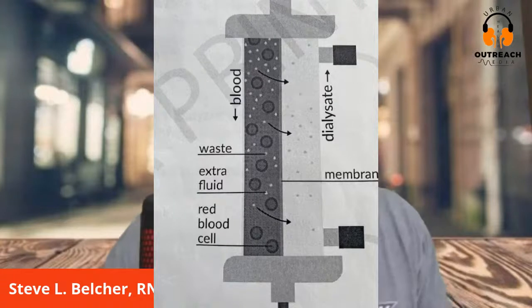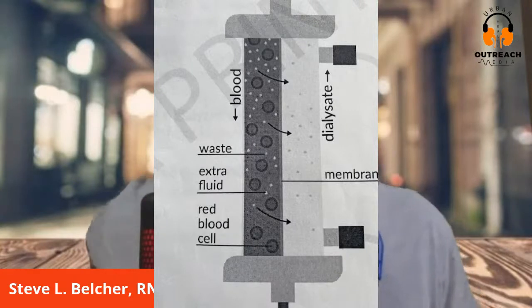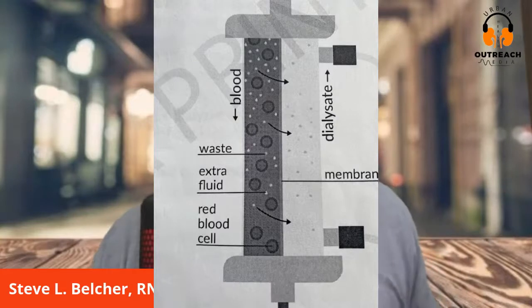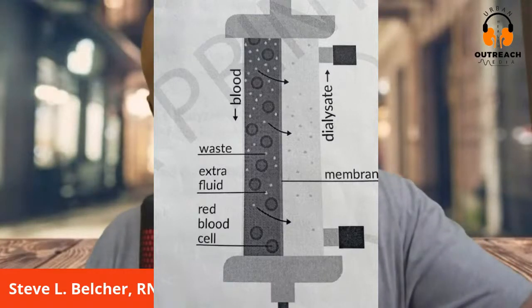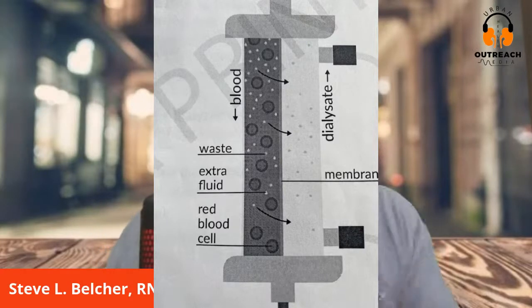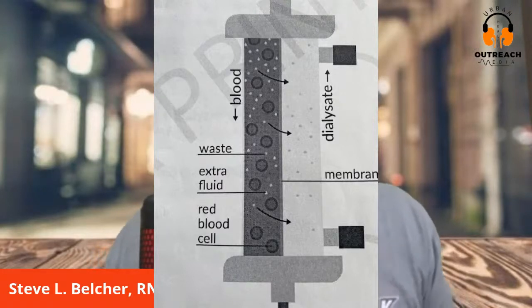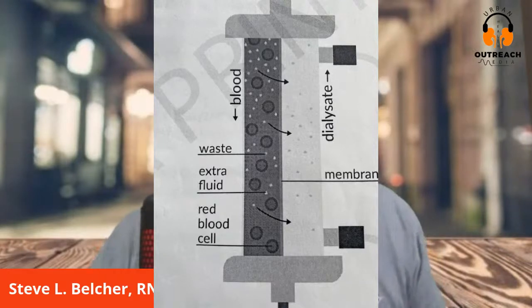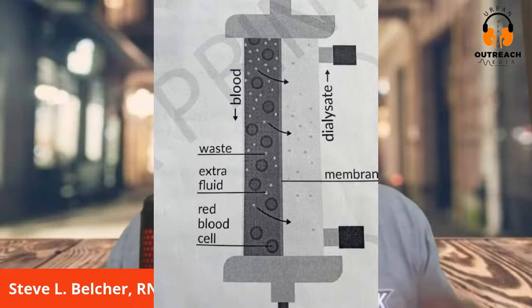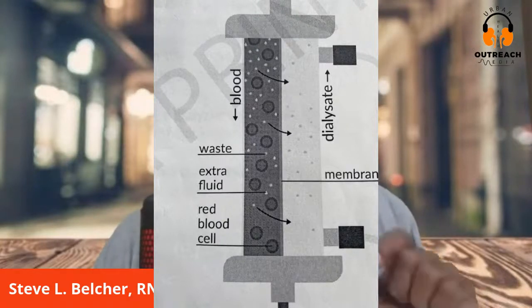So the dialyzer filters waste from your blood. Now, check this out, guys. Only about 2 cups, that's it, 2 cups of blood leave your body at any given time. That's only about 9% of your blood. There are 2 sections. Now, here we go. This is where the magic happens. There are 2 sections inside the dialyzer. One section contains blood and the other contains the cleaning solution or dialysate. These 2 sections are separated by a filter called a membrane. Through this membrane, water and waste can fit through, but blood cells cannot.